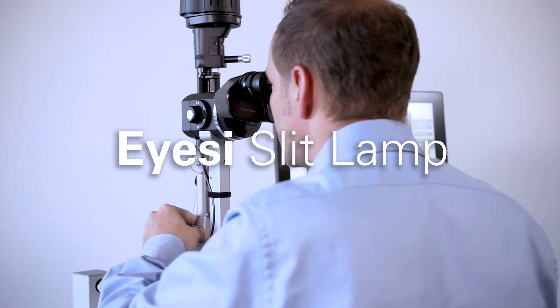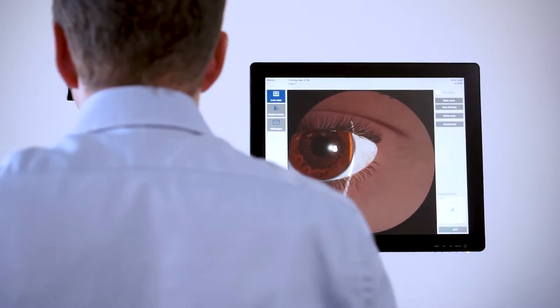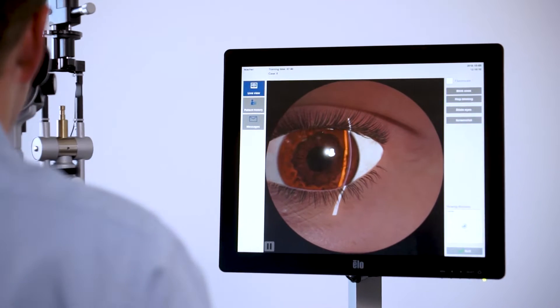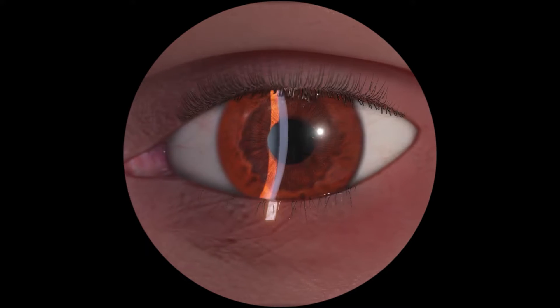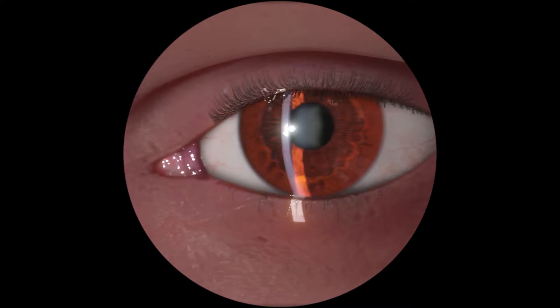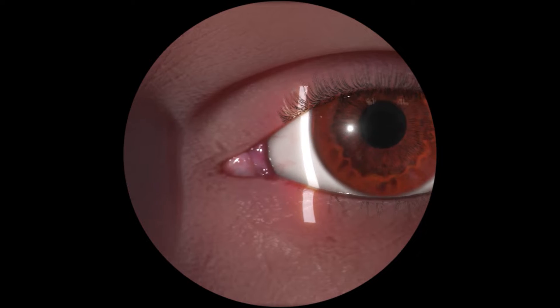Eyesi Slit Lamp is a new virtual reality simulator for training of eye examinations. The slit lamp is a key tool in detecting eye diseases.